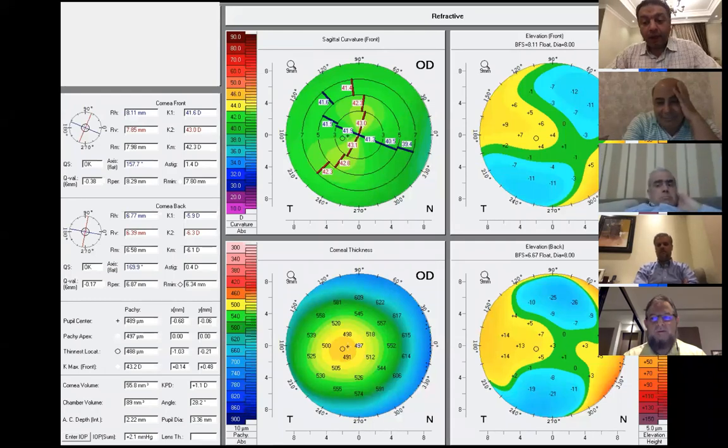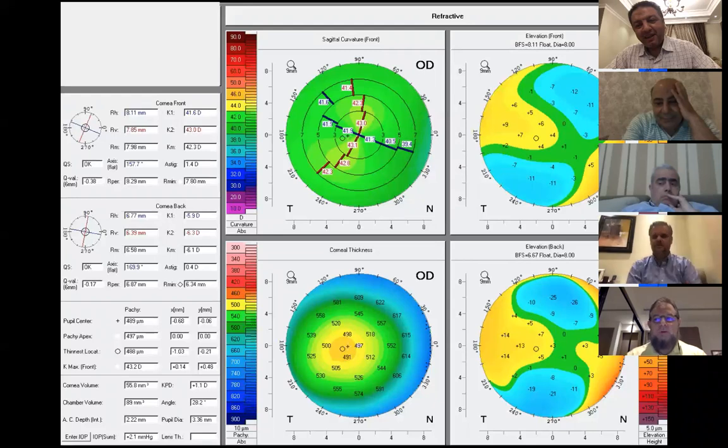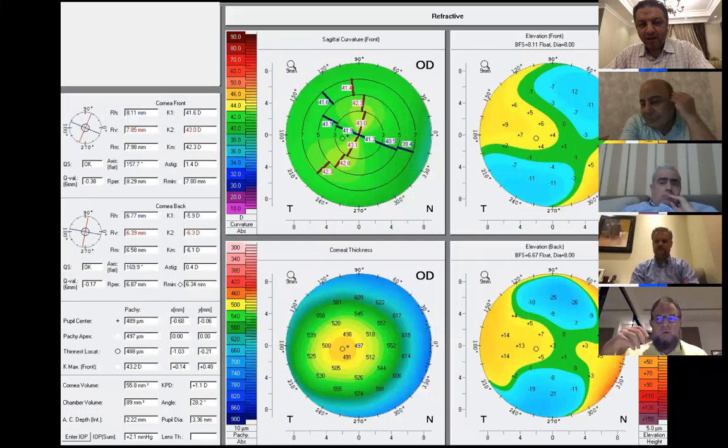Okay. At presbyopic age, he will benefit a lot from the correction for distance. Especially with the creation of spherical aberration with the hyperopic treatment, the cornea becomes prolate, or even hyperprolate, and this gives him depth of focus.